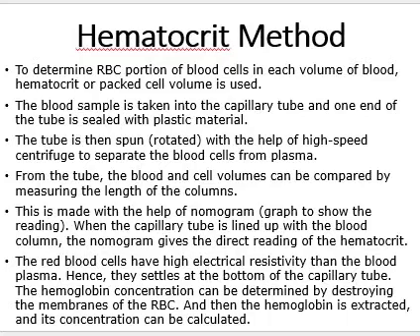One end of the tube is sealed with plastic material, in the sense it is lidded completely. Then the tube is rotated at high speed in a centrifuge.